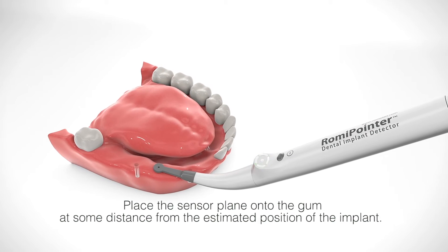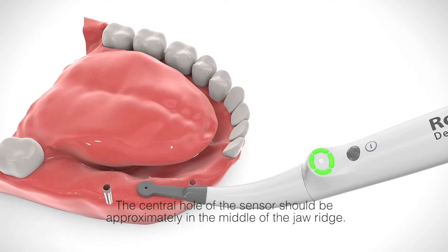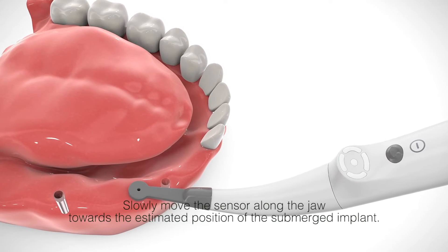Start at some distance from the estimated position of the implant. The central hole of the sensor should be approximately in the middle of the jaw ridge. Slowly move the sensor along the jaw towards the estimated position of the submerged implant.